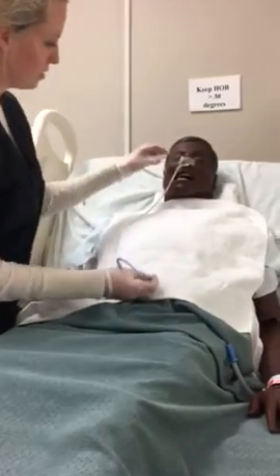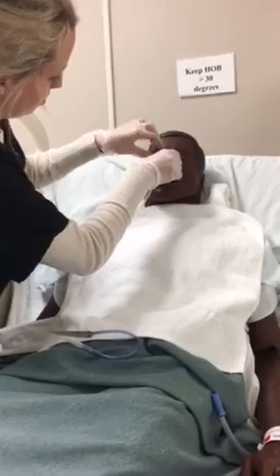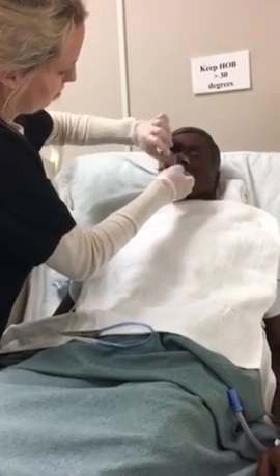So that I verified placement of the tubing. And then I'm going to provide privacy with the curtain, and fix the tape just to make sure that it's nice and secure. And then I'm also going to remove my marking tape. I'm going to raise the bed to a working height.